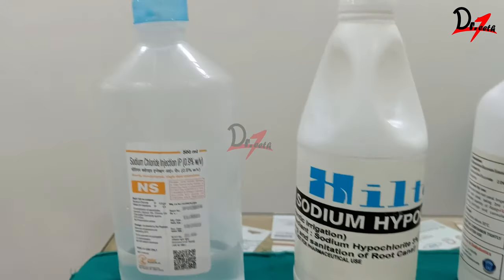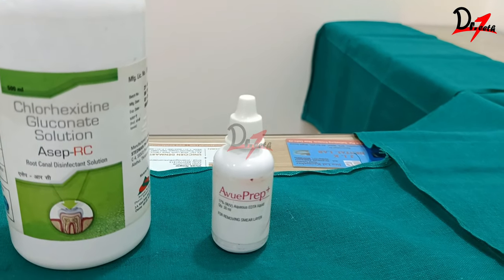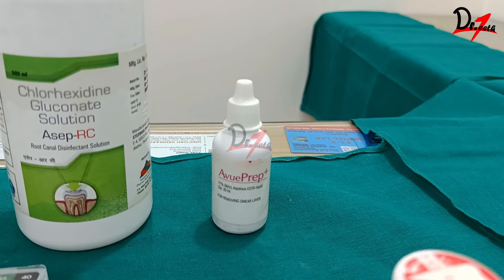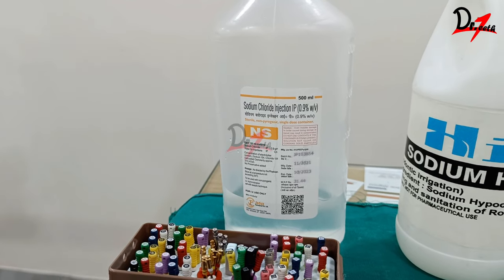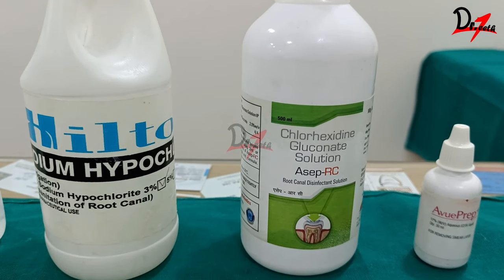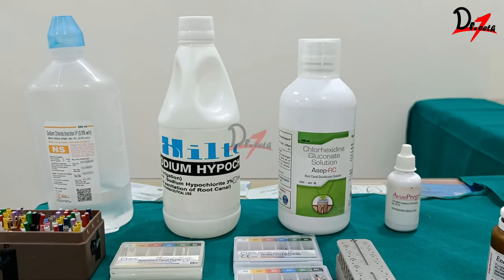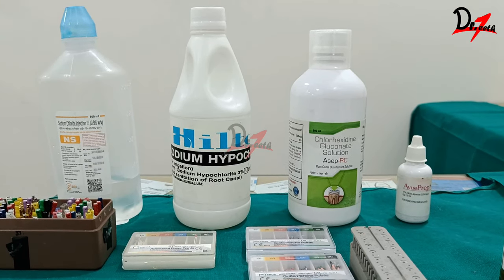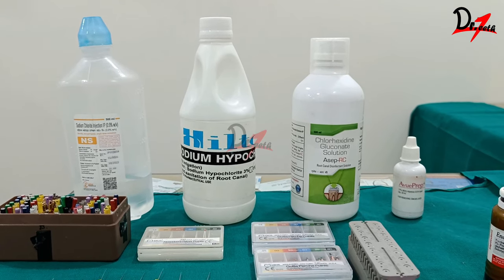After sodium hypochlorite, rinse with normal saline. Then use 17% EDTA as an irrigant to remove the inorganic portion of the smear layer, followed by normal saline to rinse out the EDTA. After that, use chlorhexidine gluconate as the final rinse, because it has the property of substantivity — meaning it can maintain antimicrobial efficacy within the root canal for a prolonged period of time.